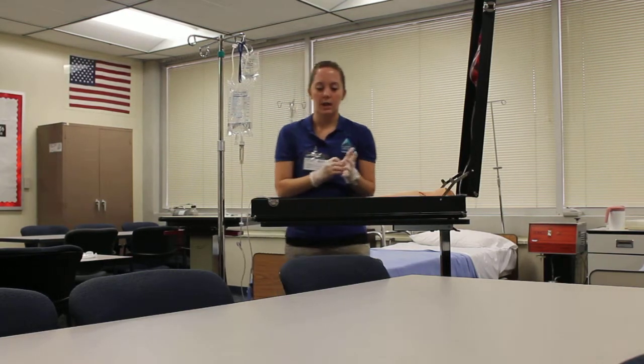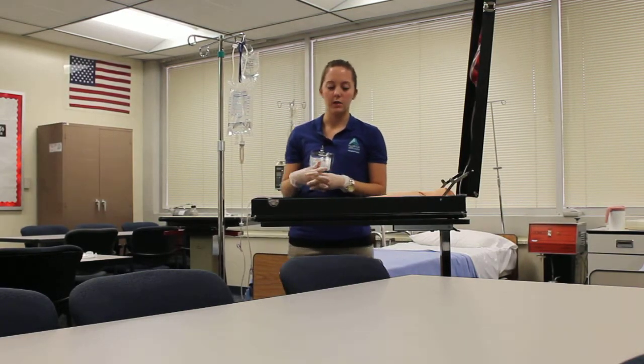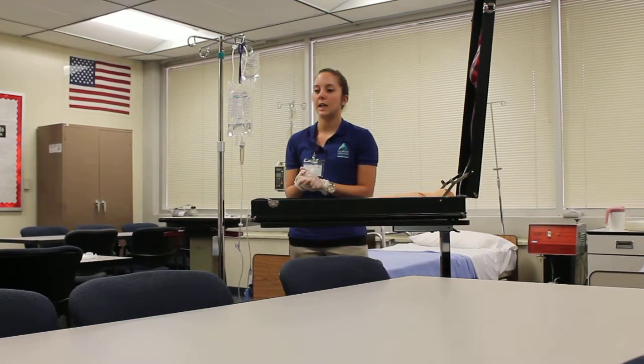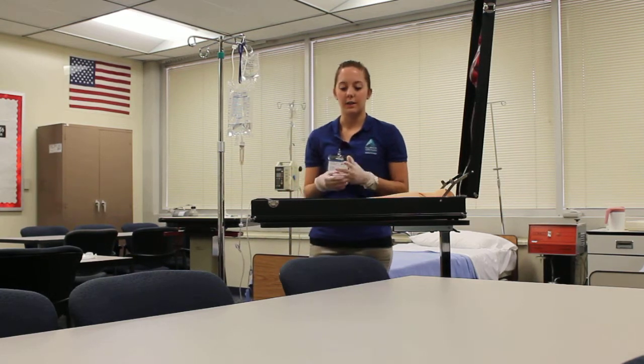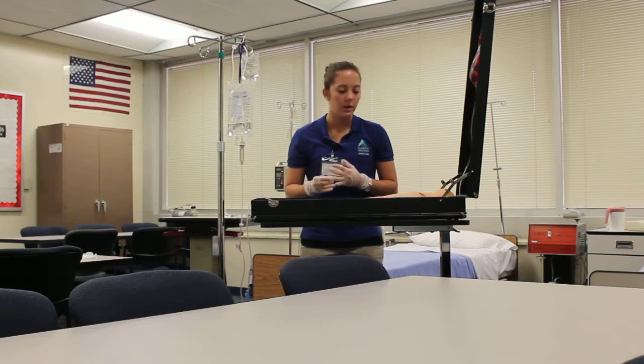I'm going to check the site one more time for infiltration or phlebitis and allergic reaction, ask the patient how it went for them. I would then take off my gloves, hand hygiene. I would document the time, the drug, the dose, the route, the condition of the IV site, and the intake and output as well. And then I would be done.